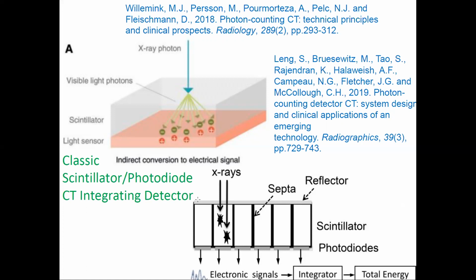You basically have a big signal in terms of the total number of secondary electrons being produced with photodiodes. You're not going to be seeing them as individual X-rays, it's not big enough for that, but you're not trying to do that. You have plenty of X-rays. So this whole thing just integrates the signal, noise, and all.